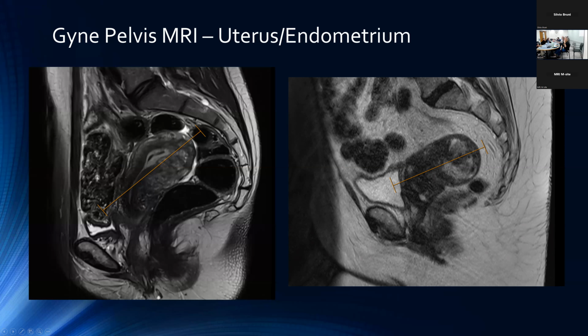But even going beyond that initial 3-month period, it goes without saying, if you ever encounter a more complex or challenging case where you're not entirely sure what the best angle for acquisition would be, feel free to reach out to the consult RAD for assistance. This is going to be some degree of a learning process, and we're always here to support you in that.